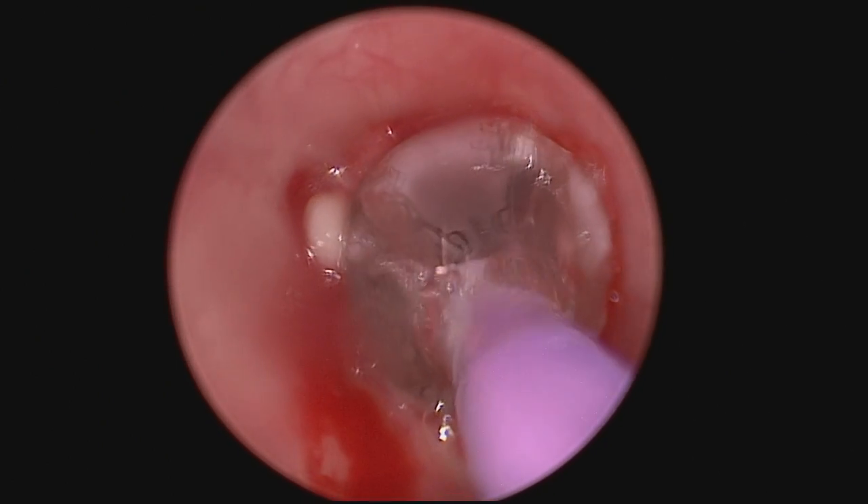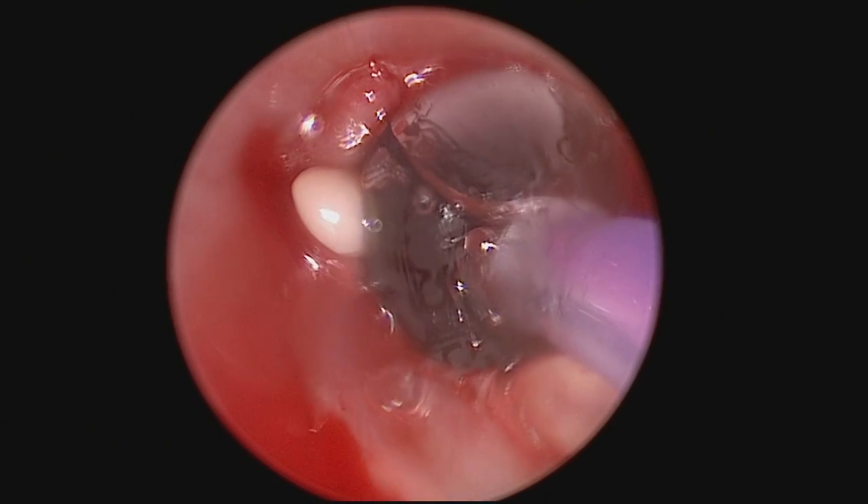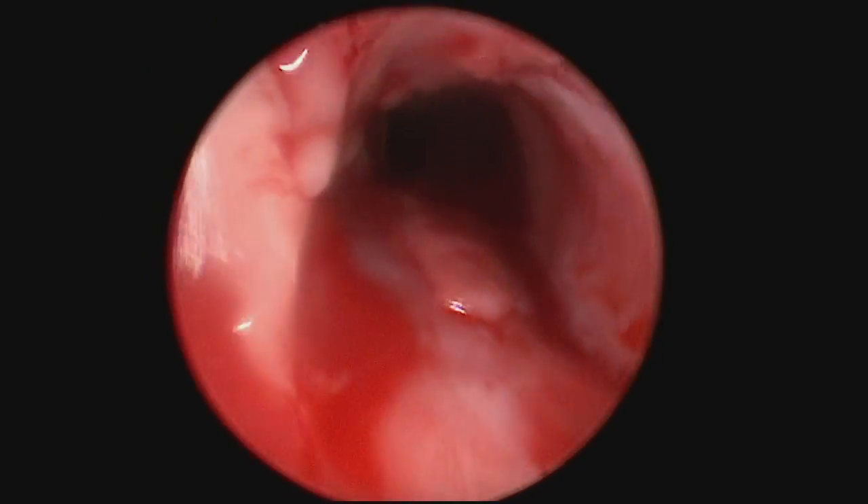I'm doing all this without a trach. The patient's breathing spontaneously. I have a little endotracheal tube on the side that allows them to get oxygenation as well as gas during the procedure.